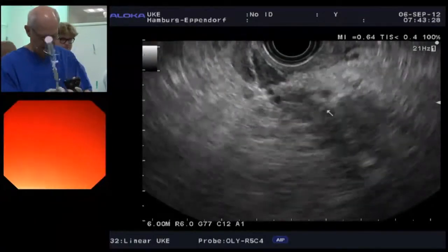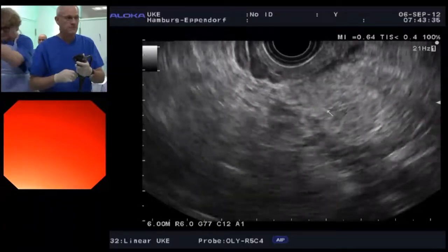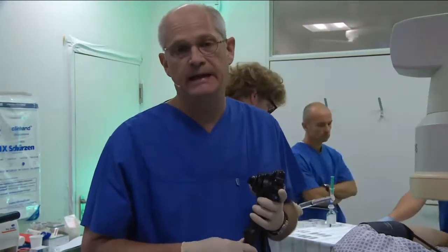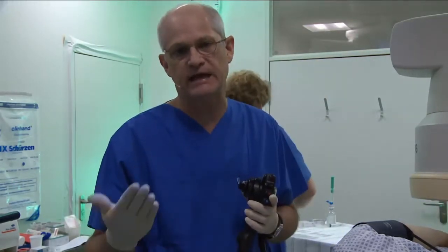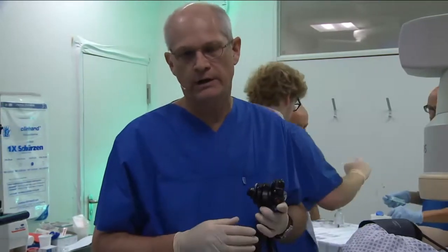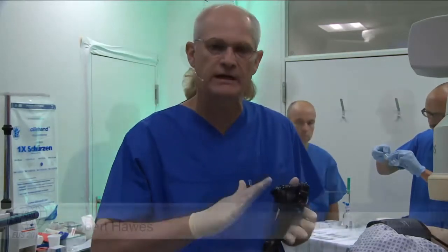What I mean by it being dynamic is that maybe I've got a good specimen in this situation, maybe I don't. So we'll look at the specimen and see what it looks like. And if I'm extra bloody, then I'll change my technique for the second round. If there's no cells and no tissue at all, then I may be more aggressive the next time with longer back and forth, maybe suction, etc.